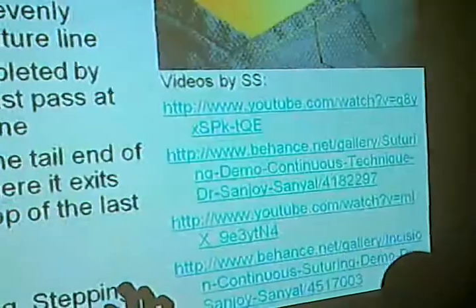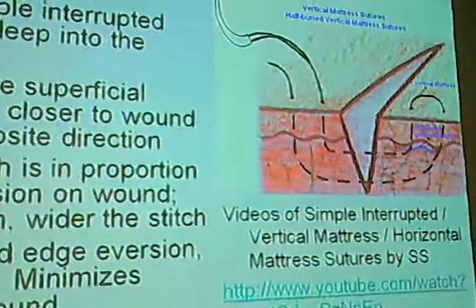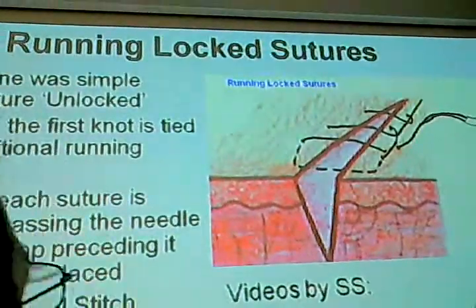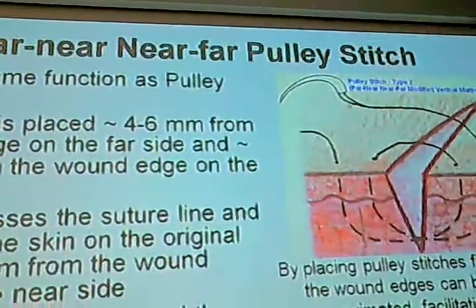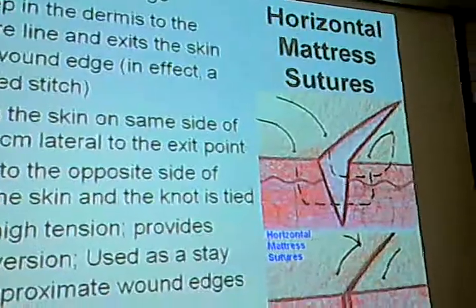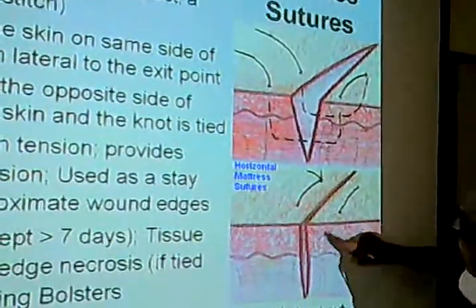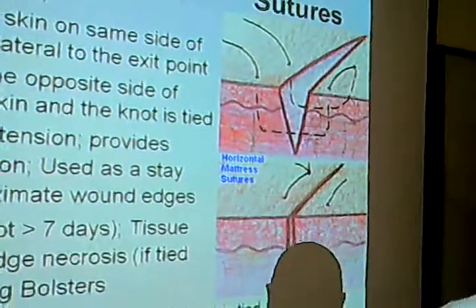Now what we're going to do is the next one. Can you flip the next one, please? No, go back to the previous. The horizontal mattress. Where's the horizontal mattress? Go down. Horizontal mattress. The horizontal mattress, we will go in this axis. That's why it is called horizontal mattress. And you'll find that it is not very difficult.